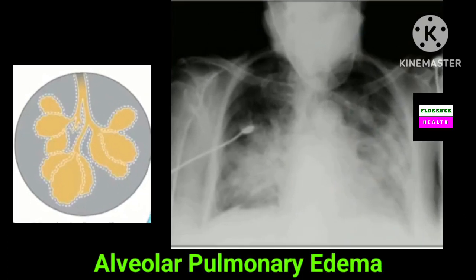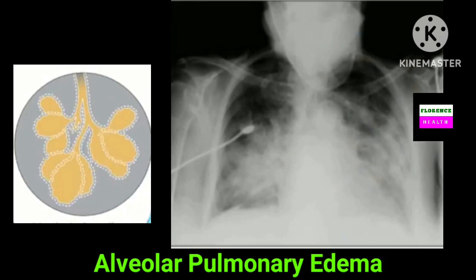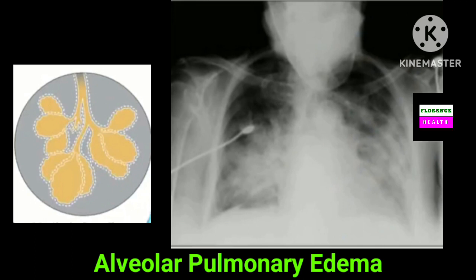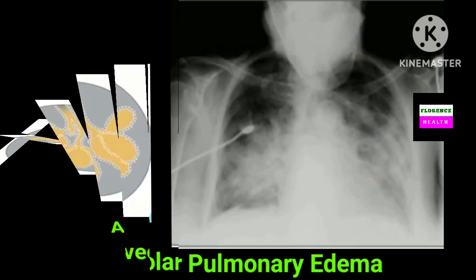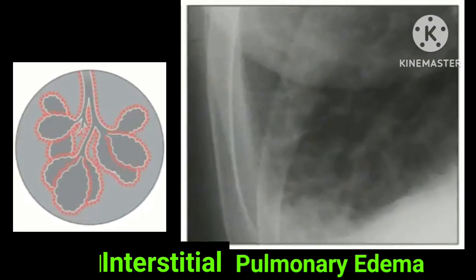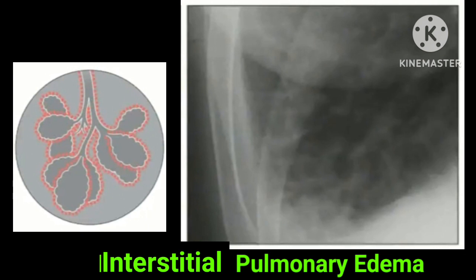In this case, the patient was dyspneic and had pink frothing sputum. On examination: decreased oxygen saturation, and crepitations and ronchi present bilaterally. On X-ray examination, the middle part of both lobes looks abnormally white — more dense in comparison to other parts. This is a case of pulmonary alveolar edema. Another slide shows a case of interstitial edema, where alveoli look black but white lines appear around them — confirming interstitial edema.